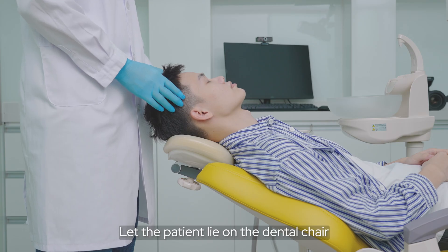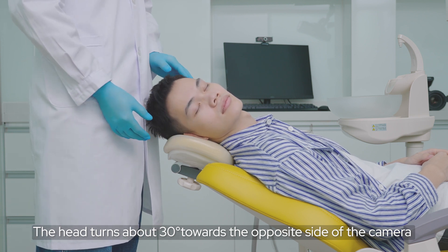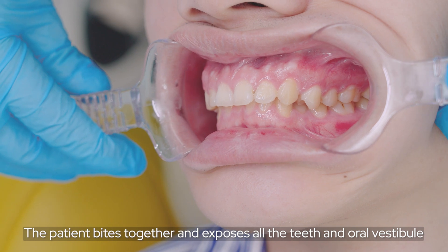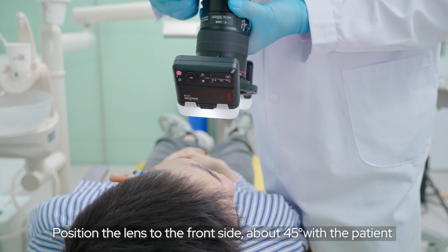Let the patient lie on the dental chair. The head turns about 30 degrees towards the opposite side of the camera. Use the retractor to pull the lips. The patient bites together and exposes all the teeth and oral vestibule. Position the lens to the front side, about 45 degrees with the patient.